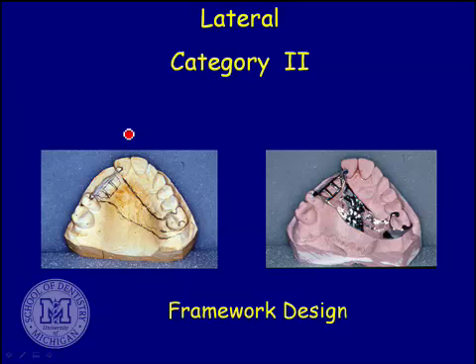Question: what is the minimum? How much undercut? It's sort of like any daylight we can see is good enough. More is better. If we've got much in excess of 10 thousandths, we may not need any more than 10 thousandths, 15 at the most. But in a pinch, if you can see some daylight when everything's level, oriented level in the cast, we see a nice undercut here, and we can see daylight on either of these proximals.